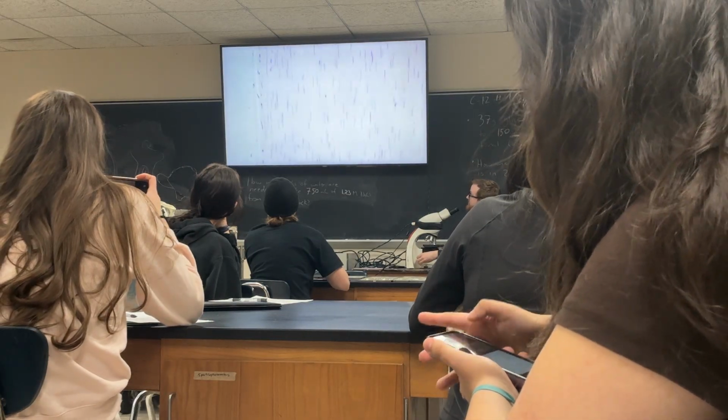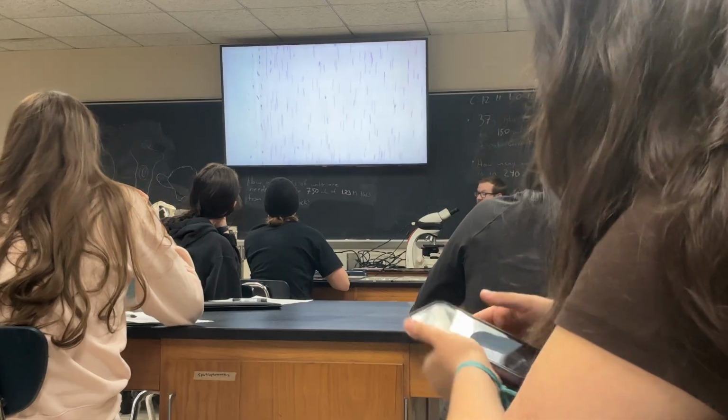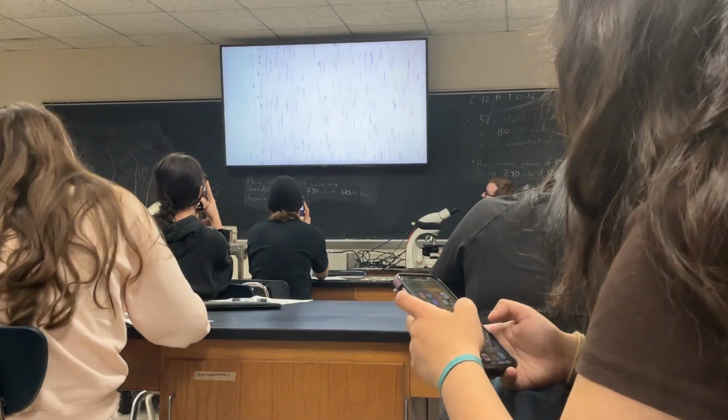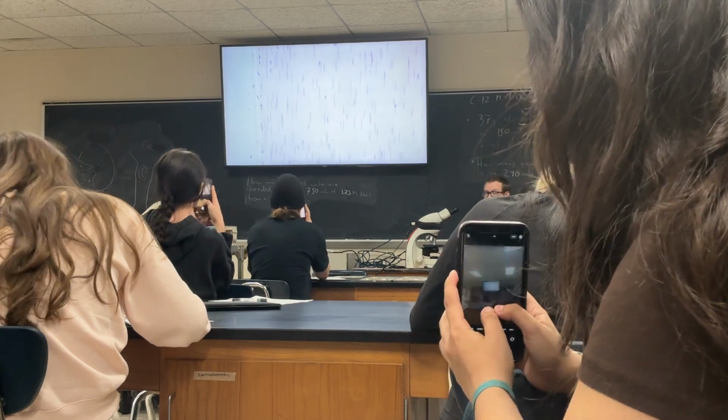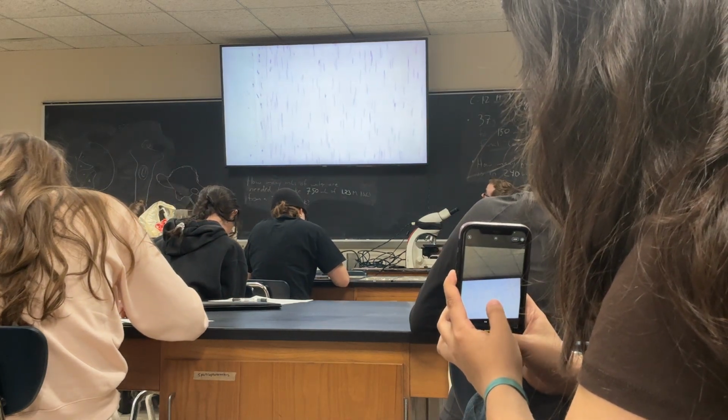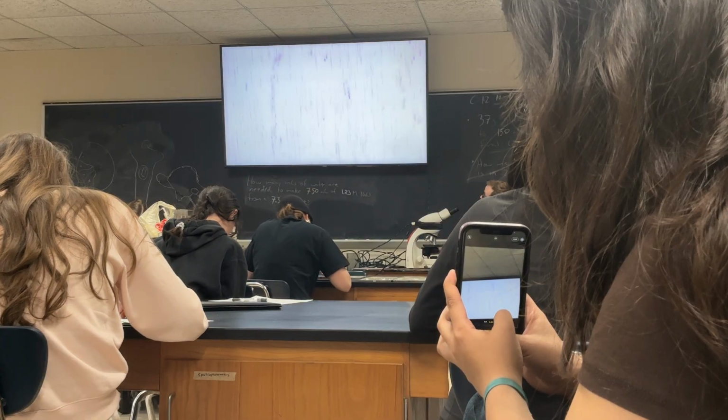But what do we notice? There's a lot more cells there than what we were just looking at. I know these nuclei are still pretty flattened, but they're not little slivers anymore. They're a little bit chunkier, especially here, which is a good view.